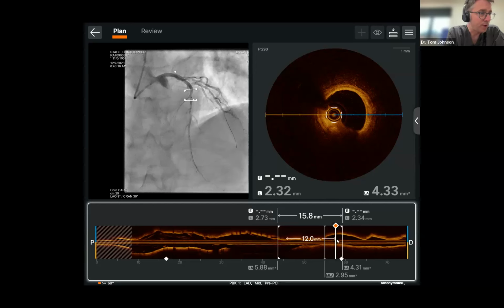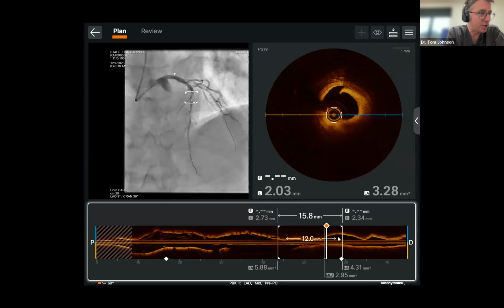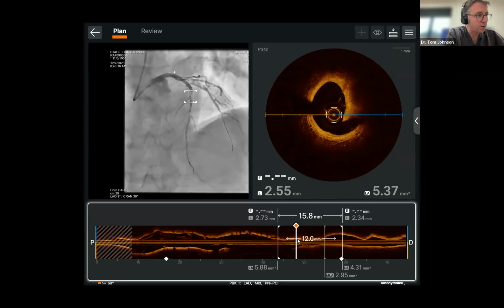So we've got an appearance here where we aren't clearing blood perfectly from the vessel wall. Now, in terms of medial engagement, it looks like we probably do come down into the media in terms of the dissection here. And we have certainly 90 degrees, if not more, quadrant of injury. So the dissection probably extends right the way around, almost 180 degrees.